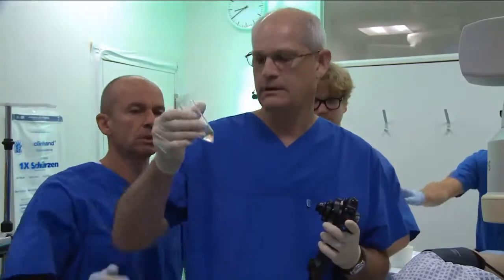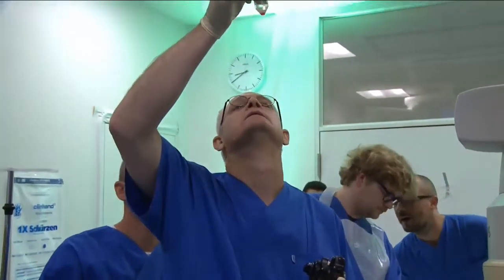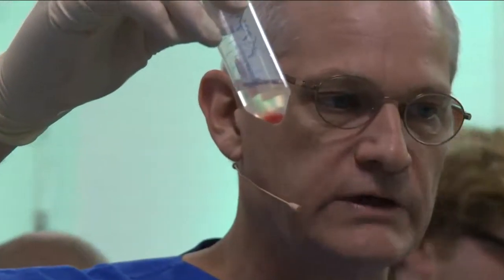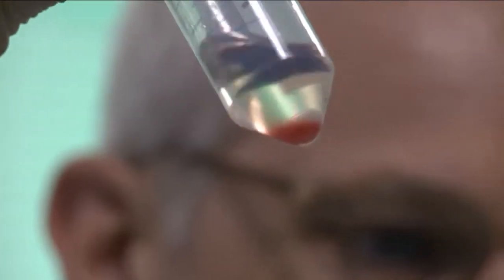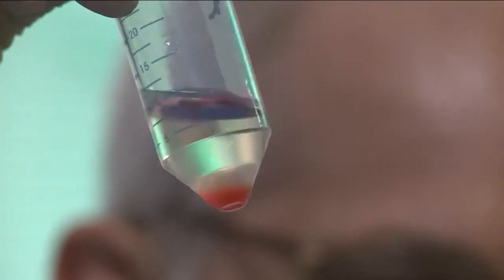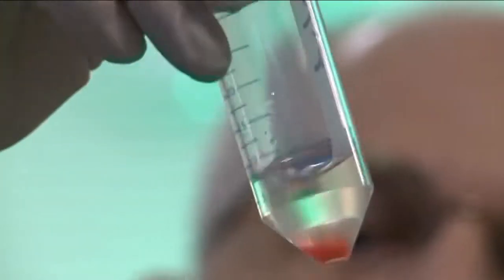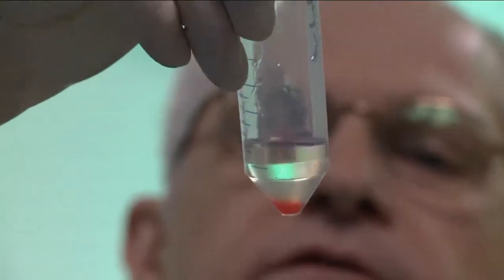Material inside. Okay. We saw it. You saw it? Yeah. Okay. So I don't know if you can see this. This is the specimen for cell block. There was obvious tissue in the specimen, according to Bertrand. And so maybe we have the diagnosis.